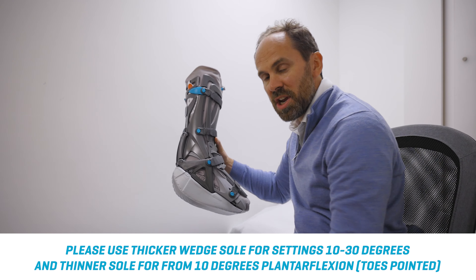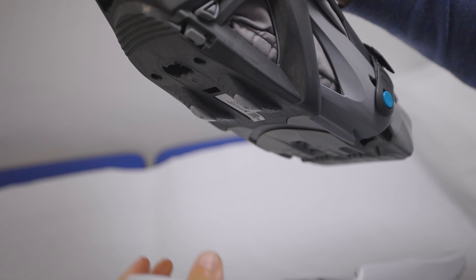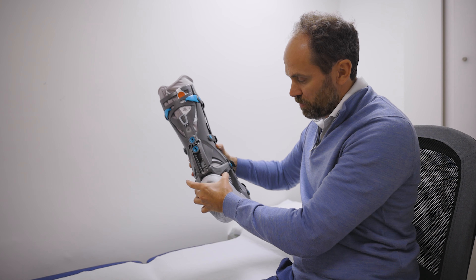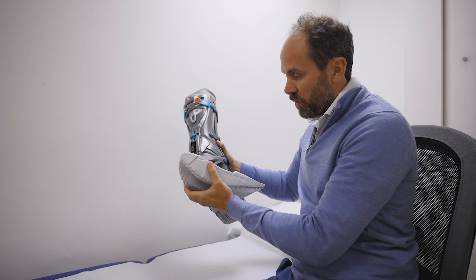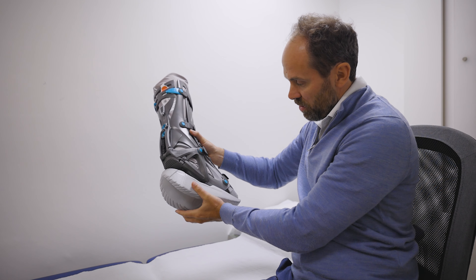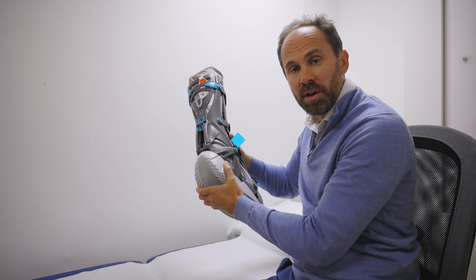If you do need to change the heel, there's just a little button on the side and the same on the other side — you just push them together and it comes off. If you need to put it back on, you can just slide it up and wait till you hear the click, and then you know it's securely on.